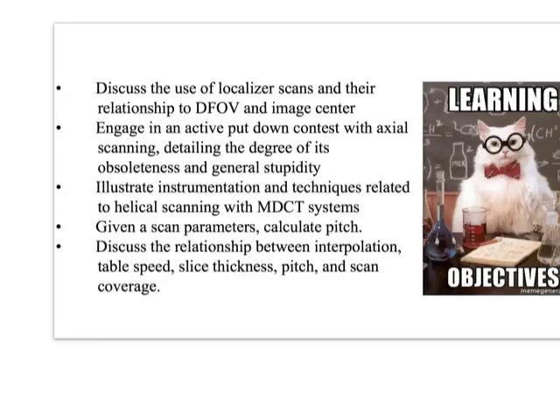And then we'll discuss relationships between interpolation, table speed, slice thickness, pitch, and scan coverage, because that's kind of a big part of what we do as CT techs as we're determining the area that we're going to scan. We're making a lot of determinations about the quality of the images that are going to come out of that scan.